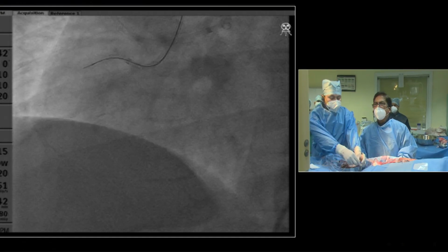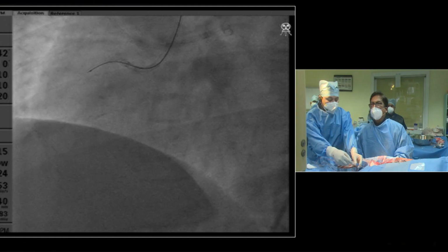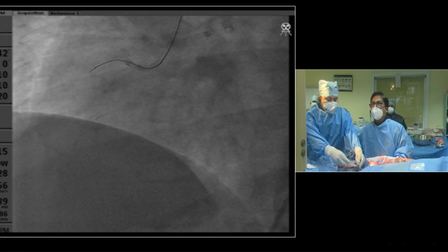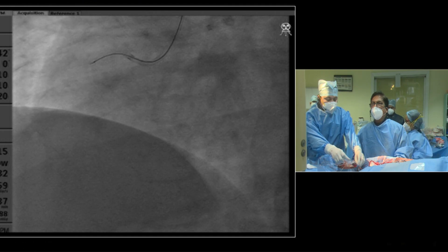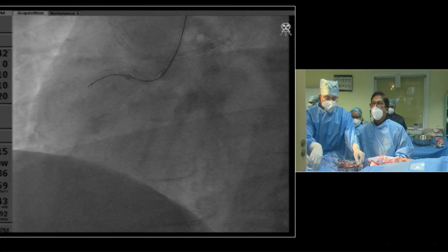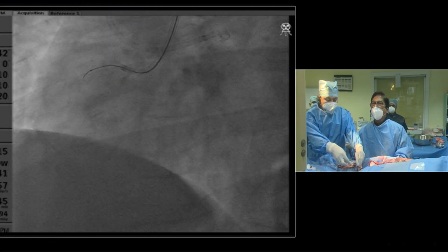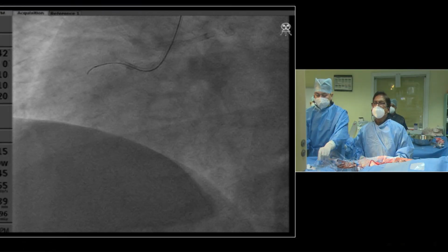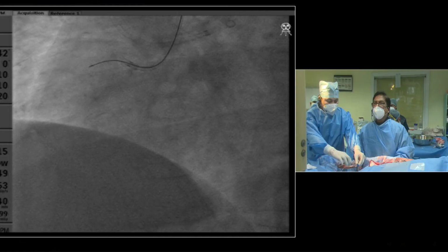Sometimes you will, so again, yeah. Tell me after. So you've taken a Gaia Second now to escalate. So again, the question that normally many of our people would have is that we do have a tendency to shape our wires, but the Gaia series already comes with a pre-shaped tip. How often do you need to reshape your Gaia wires? I think Goel sir, you can. I don't reshape them. I don't also reshape.